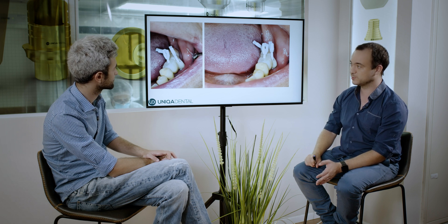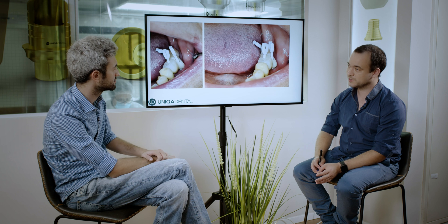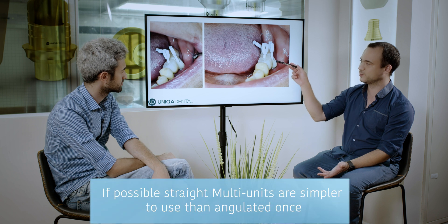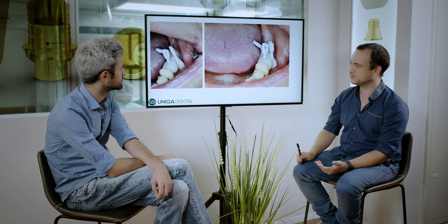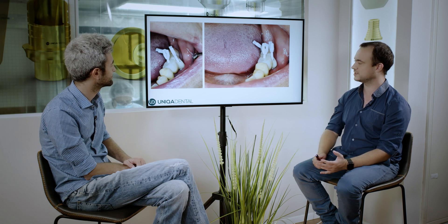Everything here was made on straight multi-units, not angulated ones. Why? Because when you can use straight multi-units, it's much simpler to make the work. Also, if you wanted to use an angulated multi-unit in this area, you don't have the option — angulated multi-units are bigger themselves and you can't achieve zero height with them. There is not enough material as it is; you want to make the bridge as strong as possible.